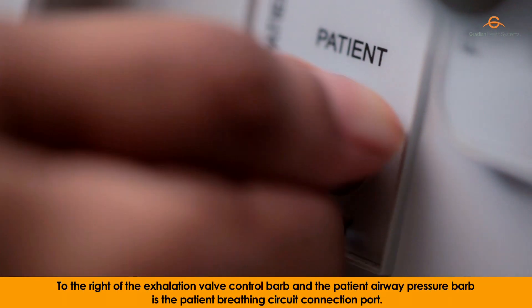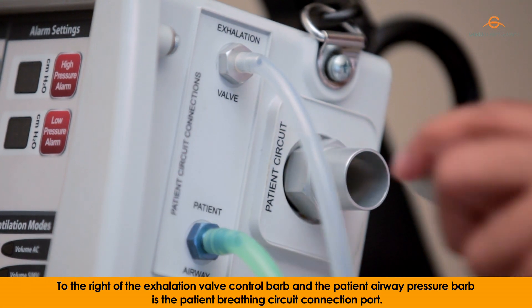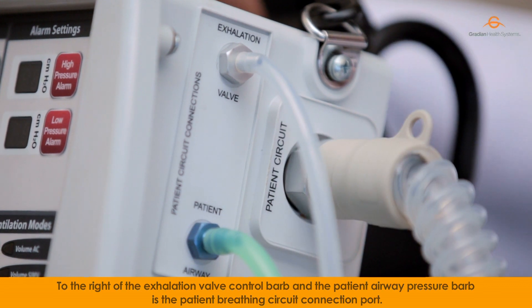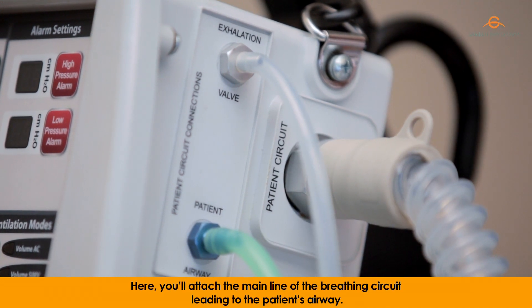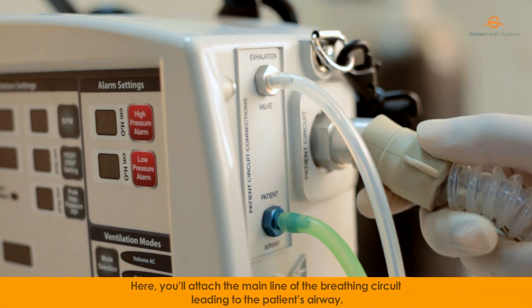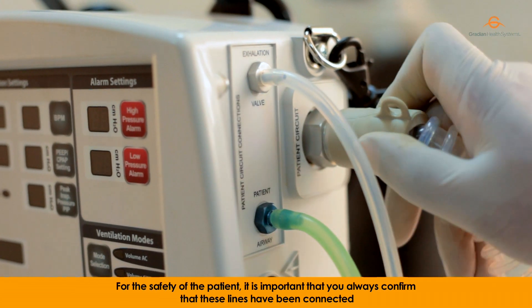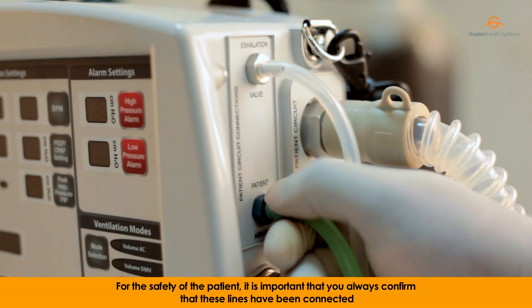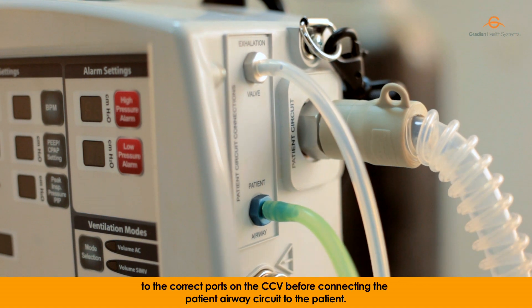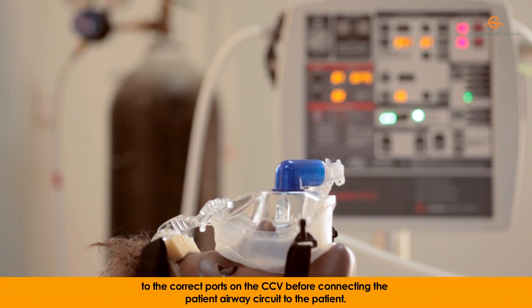To the right of the exhalation valve control barb and the patient airway pressure barb is the patient breathing circuit connection port. Here, you'll attach the main line of the breathing circuit leading to the patient's airway. For the safety of the patient, it is important that you always confirm that these lines have been connected to the correct ports on the CCV before connecting the patient airway circuit to the patient.